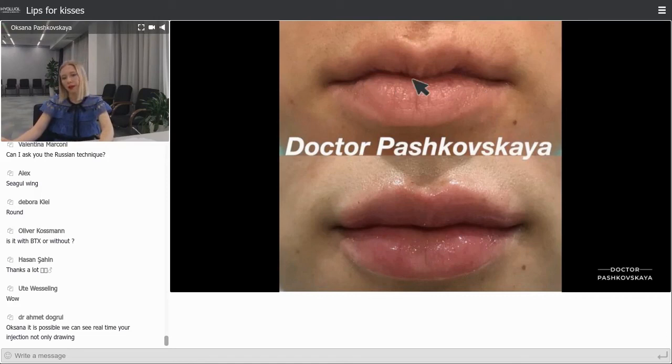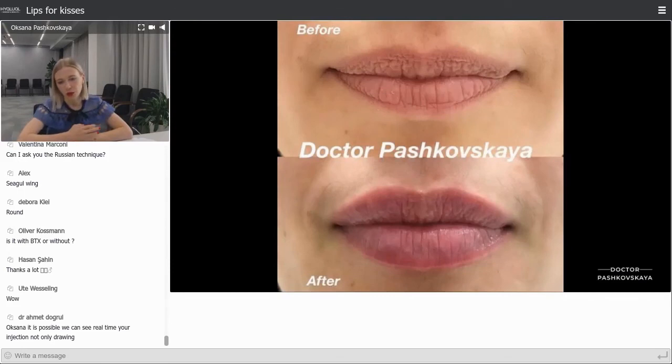Here it was like fan technique. And of course, here in the philtrum point I did not inject, and maybe I also injected in the columns of the philtrum. Pay attention that when you inject the columns, always pinch the skin, and in such a way you pressure the vessels. It's really safer to inject this zone, because it's dangerous because of the vessel supply, as you remember.